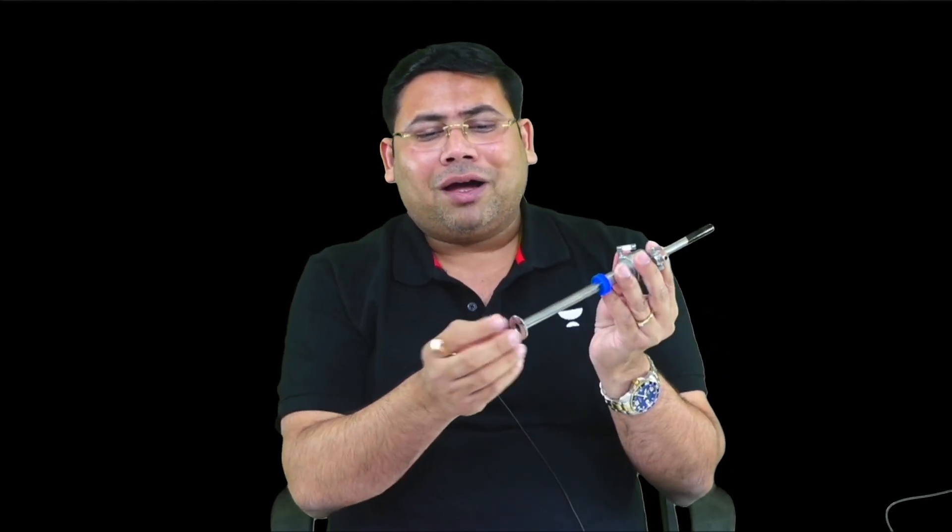Entry is made with a corkscrew movement — this entry is blind so you need to be perpendicular, and the movement must be very slow. The moment the abdomen is entered, a hissing sound comes from holes in the trocar-cannula system, indicating you are in the right cavity. This is a 10 mm port and this is a 5 mm port — this one is smooth and this is ribbed.